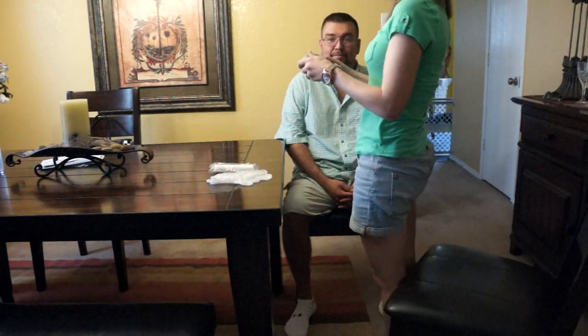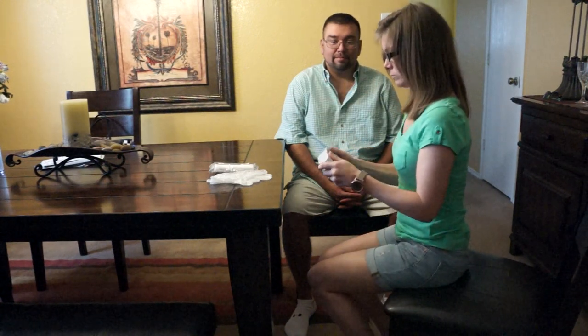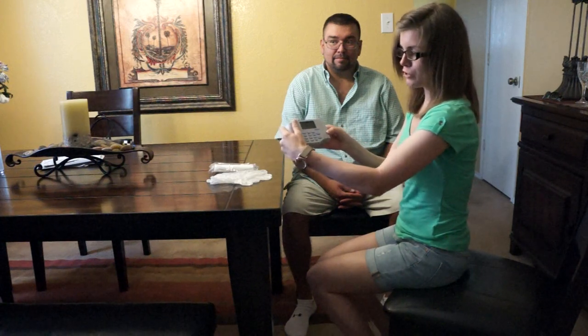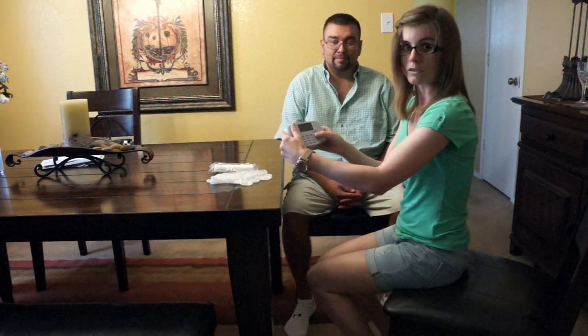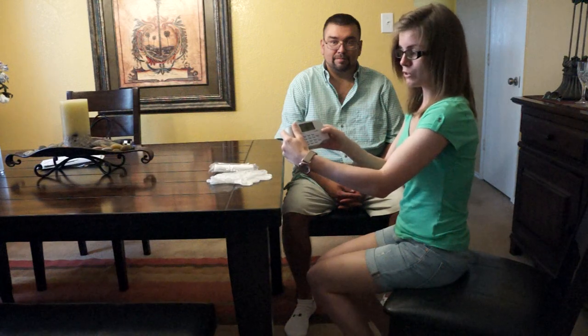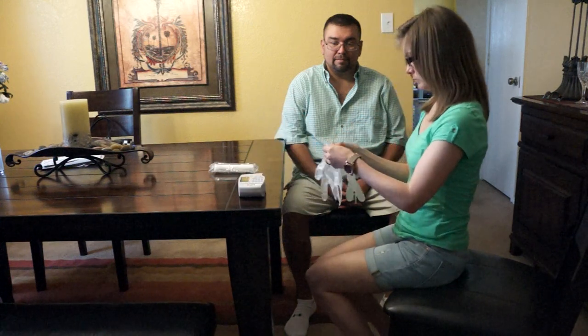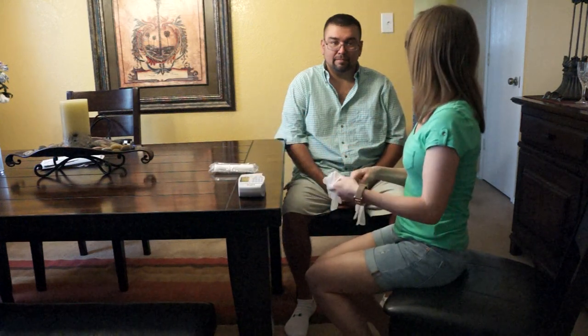Okay. So first you're going to turn on your spirometer. And usually it has an on and off button, and you just really need to hold the on button down to make sure that it turns on properly, okay? Then you're going to put your gloves on. It'll be just a couple of minutes, okay?